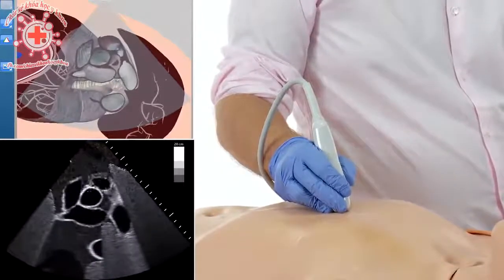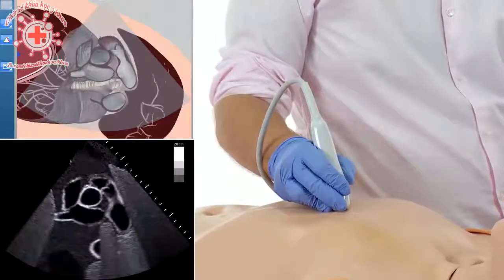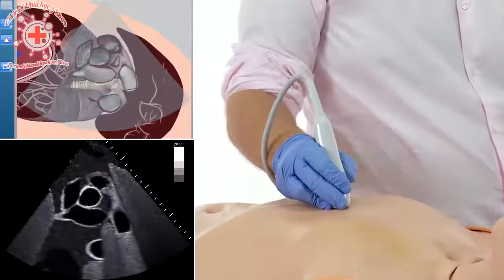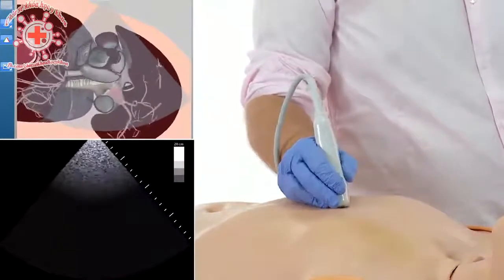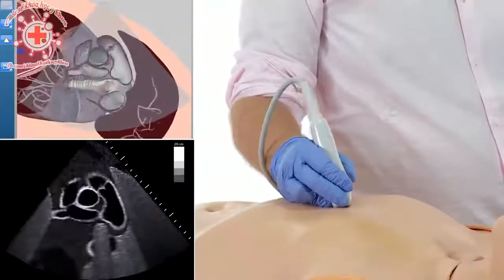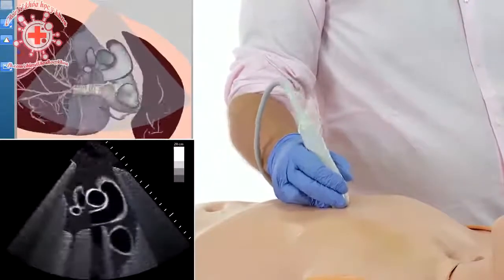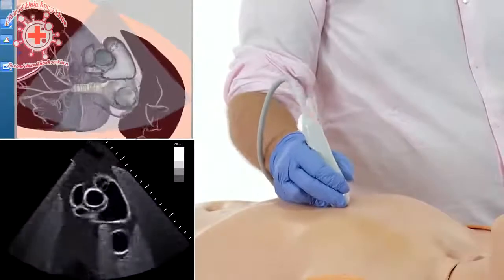Also be aware that the pulmonary artery is very close by, and very frequently you will already see the pulmonary artery in a short axis view. Sometimes, however, you will have to optimize the view, turn a little bit more to the left shoulder and tilt a little bit more, and all of a sudden you will see a very nice long axis view of the pulmonary artery and even the bifurcation between the left and the right pulmonary artery.